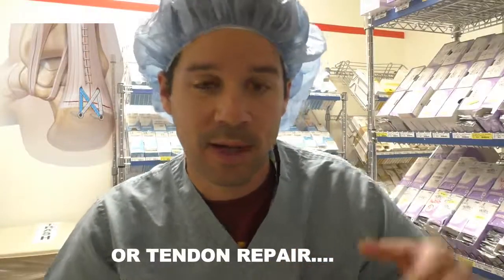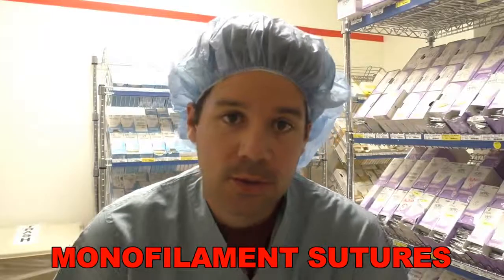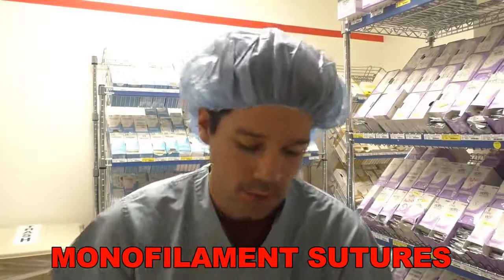You see them a lot of the times when they place anchors, and they'll use that fiber wire. It's a tough suture to break. It's tough. Now we move on to the monofilament suture, the single strand suture.